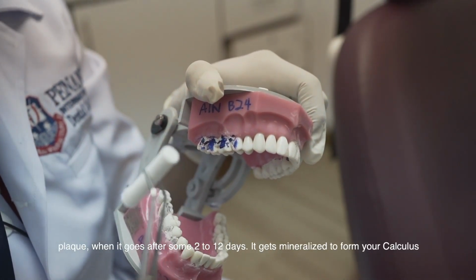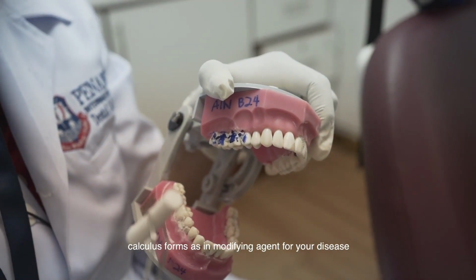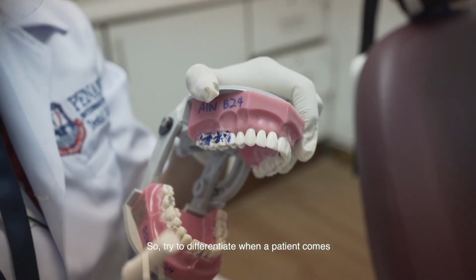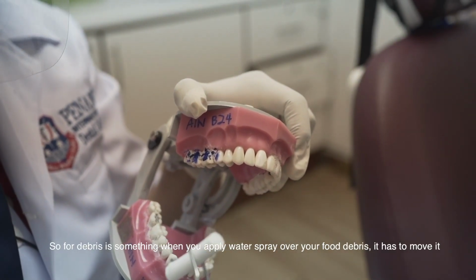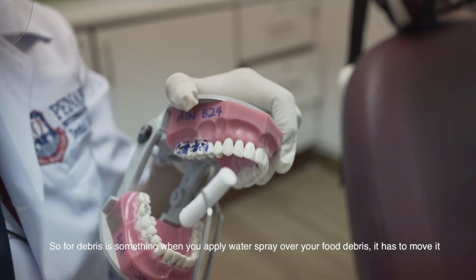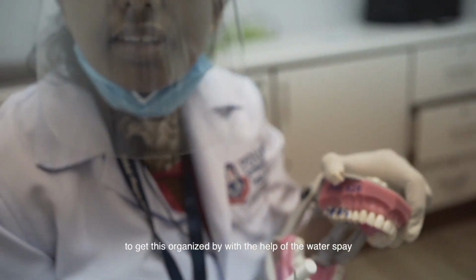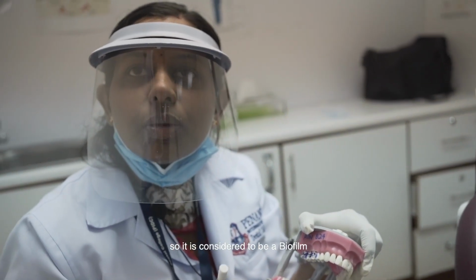Plaque, after some 2 to 12 days, gets mineralized to form your calculus. Calculus acts as a modifying agent for your disease, whereas plaque is an initiating factor for your disease. So try to differentiate, when a patient comes, between food debris, plaque and calculus. Food debris is something that tries to move away when you apply a water spray over it. Plaque, being an organized biofilm structure, is a little difficult to disorganize with the help of the water spray. So it is considered to be a biofilm.